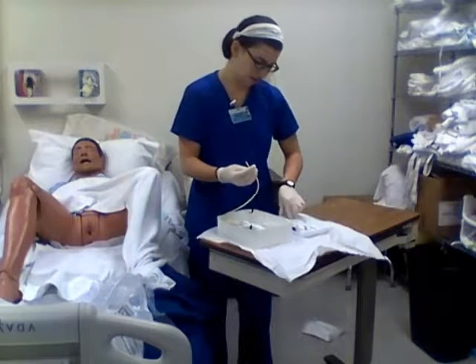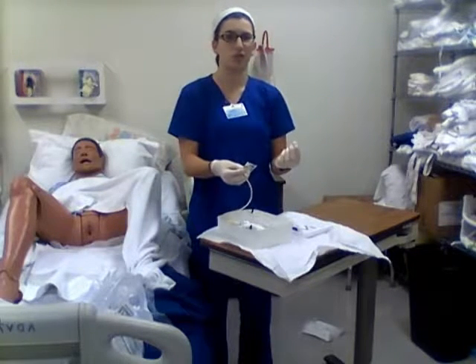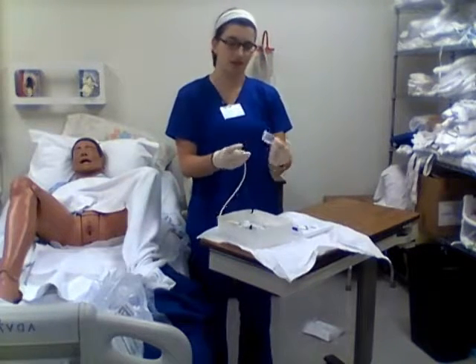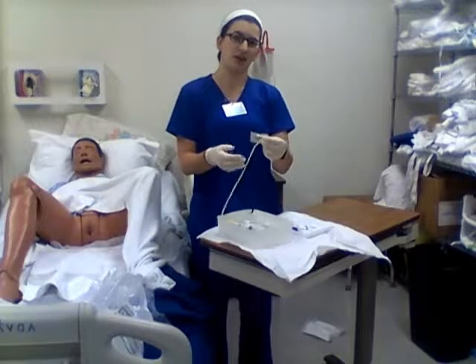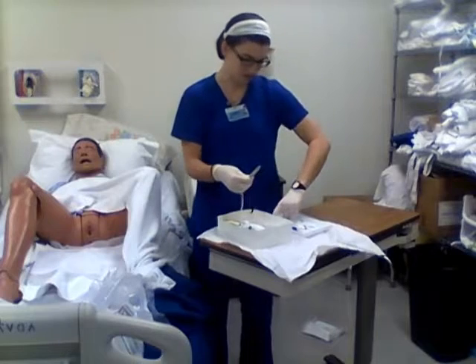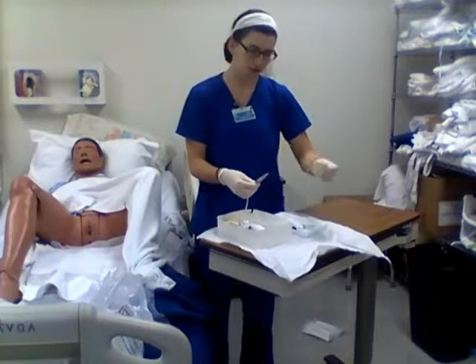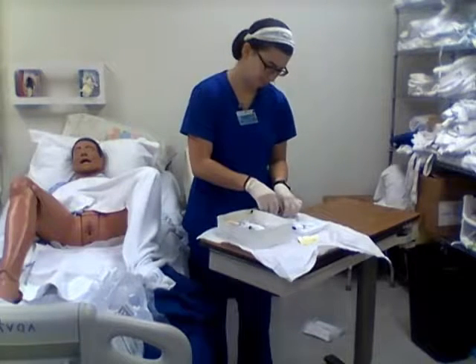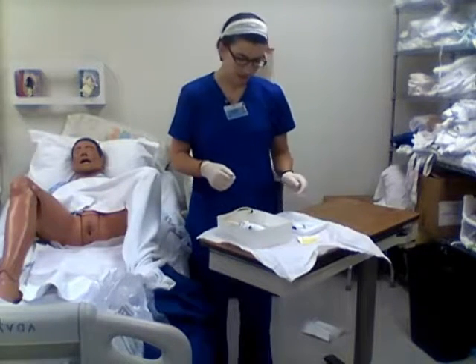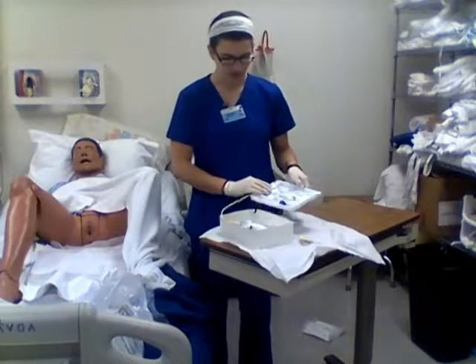All right, now we're going to take our lubricant. We're going to open this. I'm not actually going to for video purposes, but in actual reality I would. And I would lubricate the end of this catheter. So now I can go ahead, I can put it in my little tray here. And I have my name tags ready for later use. All right. So now it looks like we're all ready to go and the patient is all prepped.